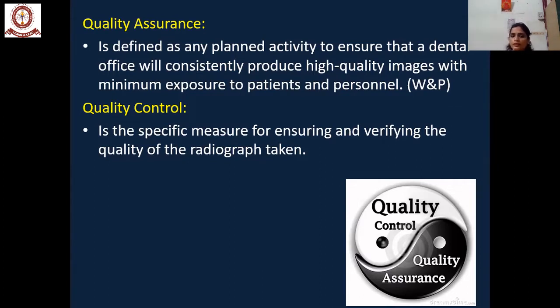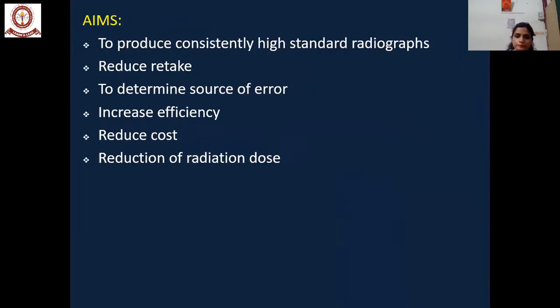So what do you mean by quality control? That is the specific measure for ensuring and verifying the quality of the radiograph taken. We have to recheck and verify whether the images taken were of good quality. That is called quality control. That is the difference you should know between quality assurance and quality control.